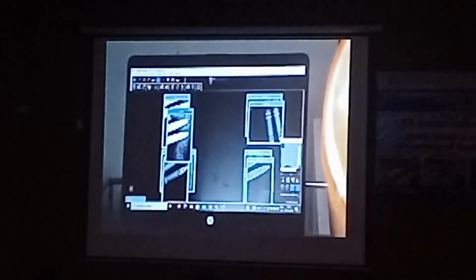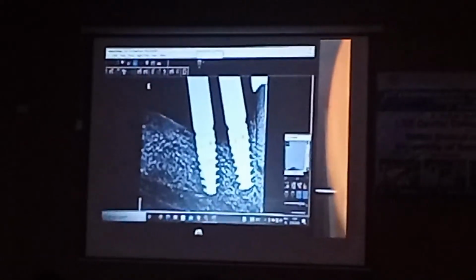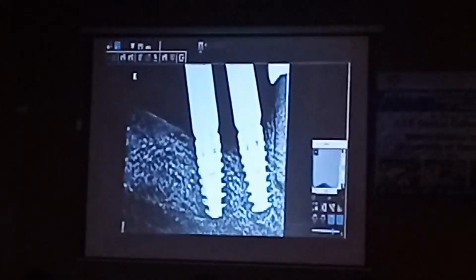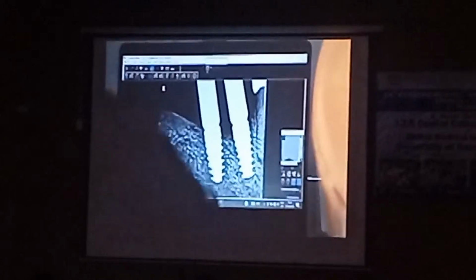The distal one is not set right. No, this is the X-ray. Oh, okay. It is fine. So this is the X-ray. As you can see, it is seated, right? So now what we are going to do is again use the same method, get the verification jig, but this time it will be much faster because the area that we have to make up is very less.